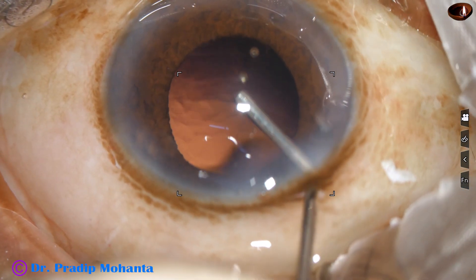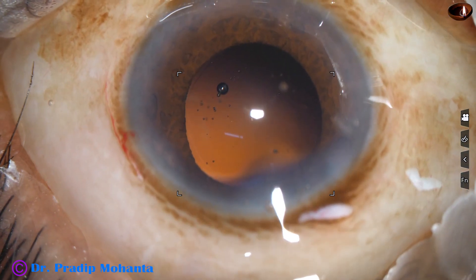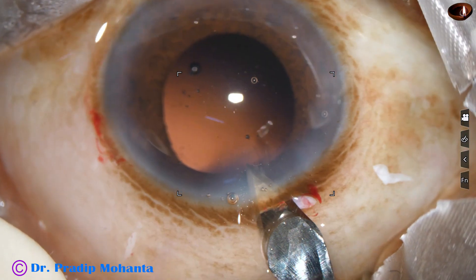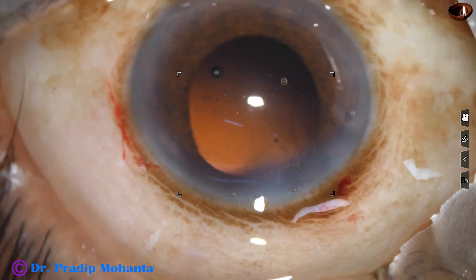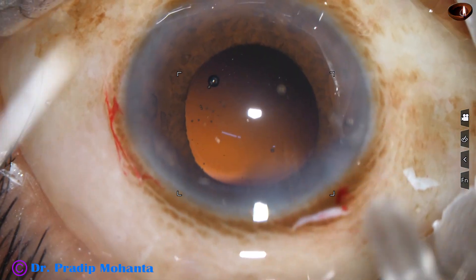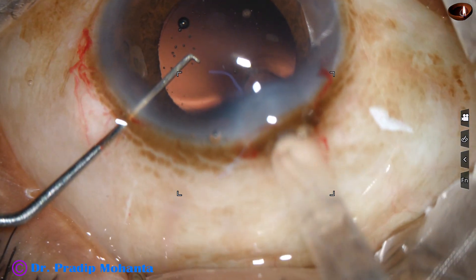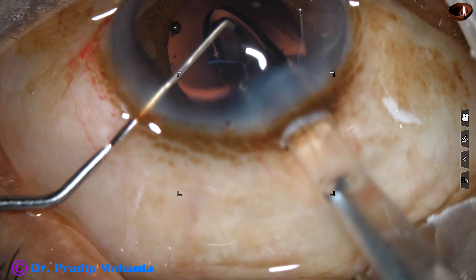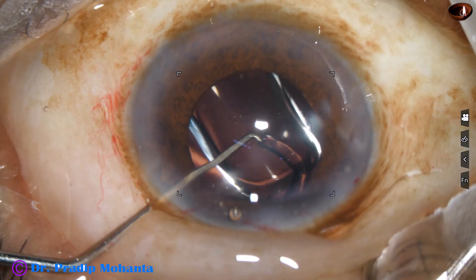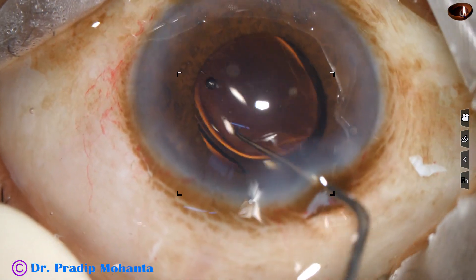The irrigation cannula lifts the anterior lip of the main wound and the anterior chamber is maintained. Viscoelastic is injected to fill out the anterior chamber and the capsular bag. A beautiful intraocular lens — Tecnis from Johnson and Johnson — is inserted. In my opinion, this is the best monofocal lens available in the market. No financial interest.